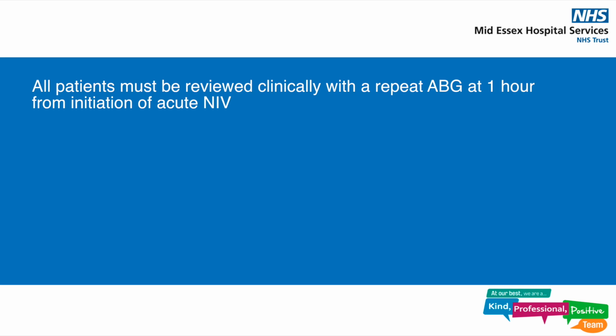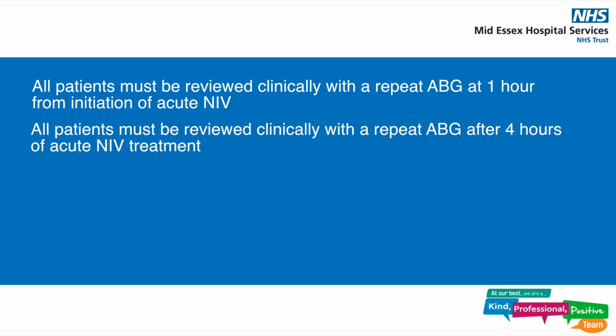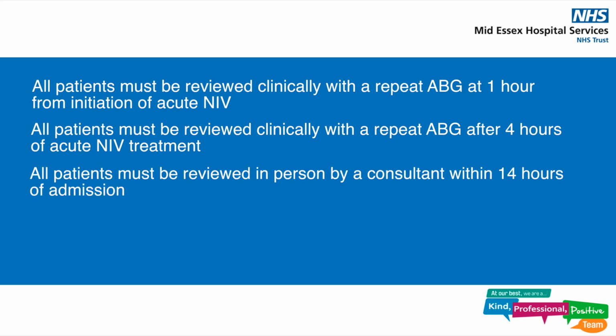All patients must be reviewed clinically with a repeat ABG at 1 hour from initiation of acute NIV. All patients must be reviewed clinically with a repeat ABG after 4 hours of acute NIV treatment. All patients must be reviewed in person by a consultant within 14 hours of admission.